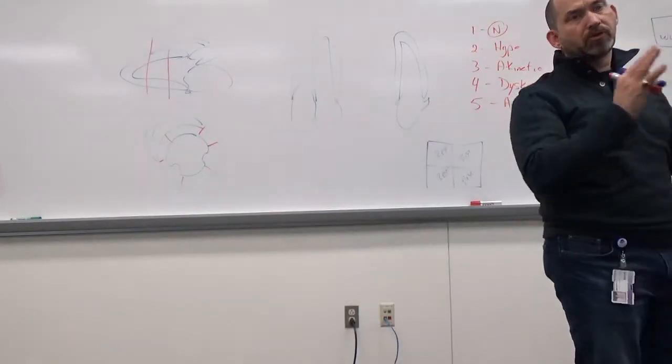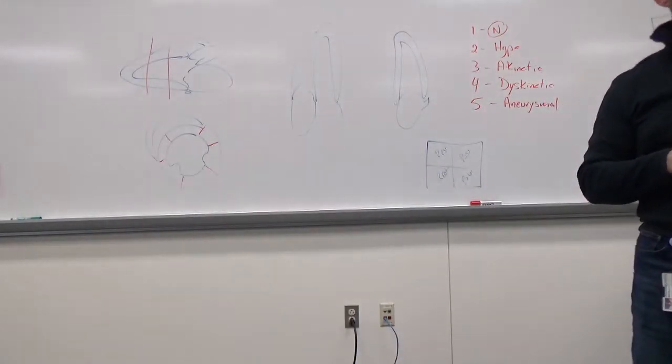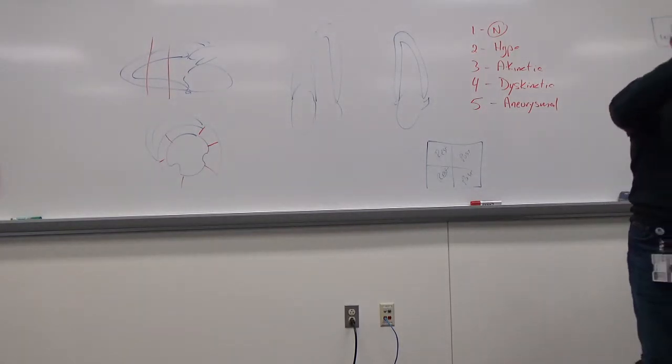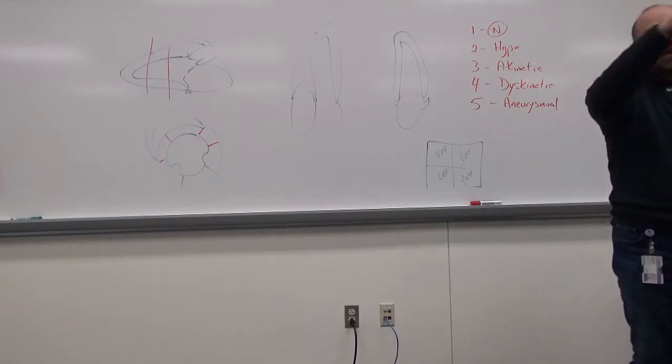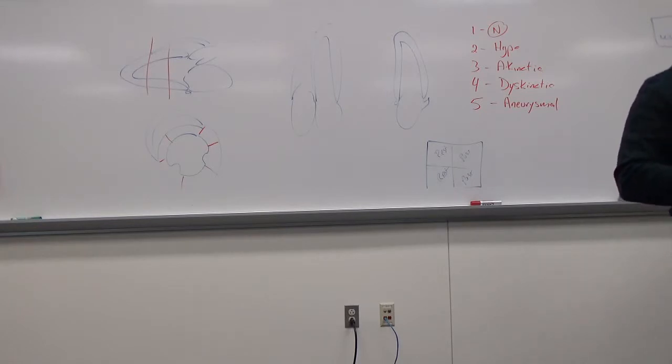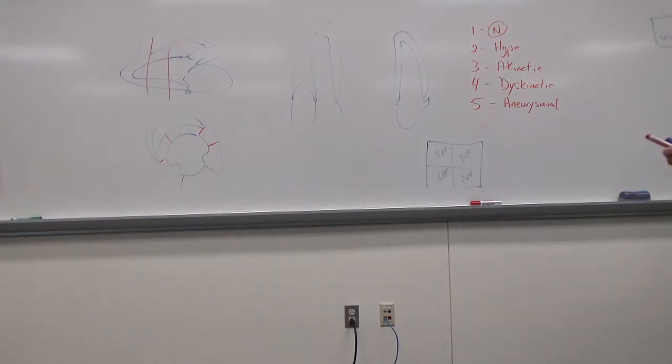What is nice about doing rest versus stress is that you'll set up your depth and everything the way it is, and the stress echo package of your system should lock that in. So when you come back to that view, it makes those changes for you and puts it back to what was optimal for that window. Which is nice. While you have the system take certain clips as you're doing your rest images, on the stress test you trigger the system, and then when you move to the next view, it takes all those clips. Then it jumps to the next view, you get your windows real quick, then you jump to the next view, and so forth throughout the exam.